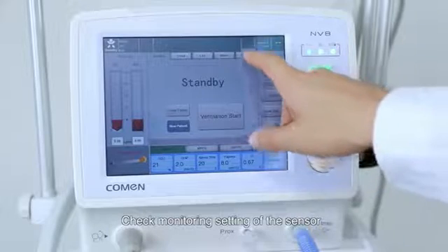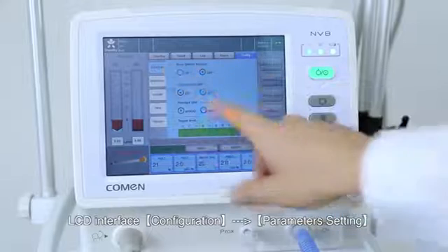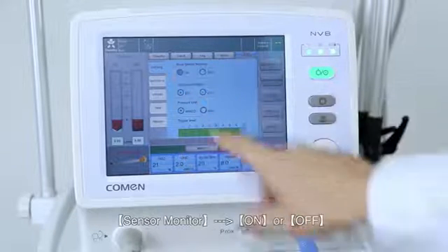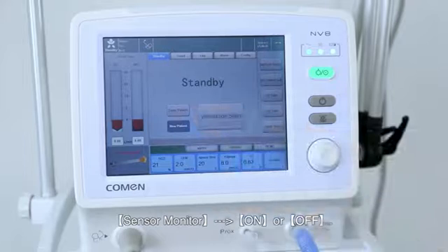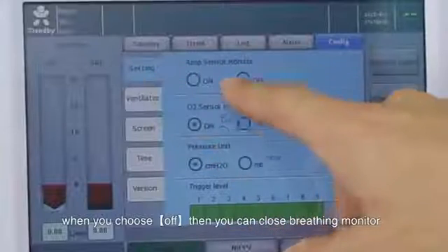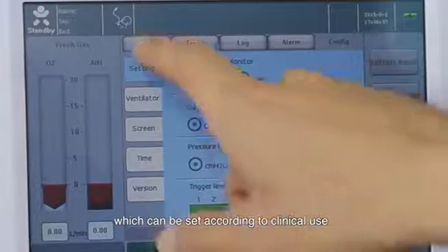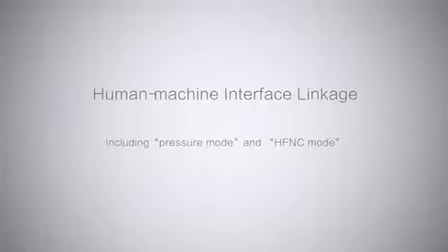Check the monitoring setting of the sensor. LCD interface, configuration, parameter setting, sensor monitor, on or off. When you choose off, you can close the breathing monitor, which can be set according to clinical use. Human-machine interface linkage includes pressure mode and HFNC mode.